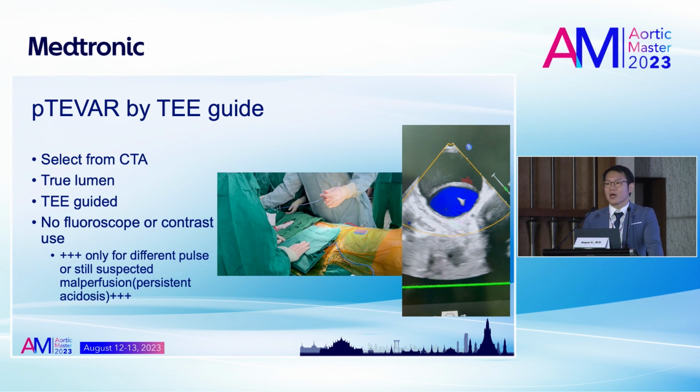And normally, for the frozen elephant trunk stent graft, I use the retrograde or antegrade fashion. So I normally start with percutaneous puncture of the femoral artery, and you can select which femoral artery can go through the true lumen. And I don't use a fluoroscopic check because normally we can use a transesophageal echocardiogram to confirm whether we put the pigtail catheter into the true lumen or not.